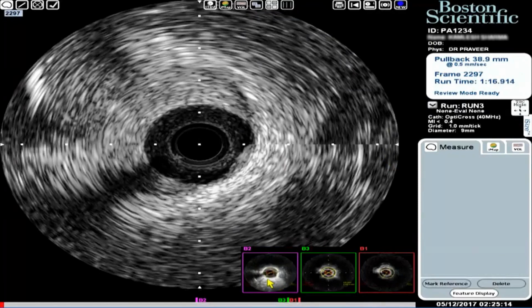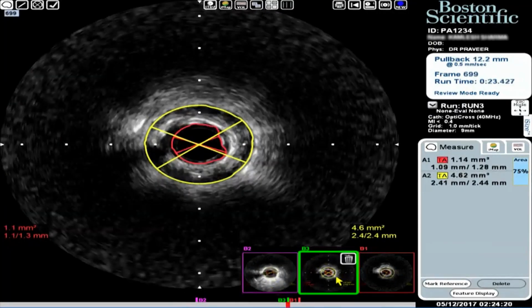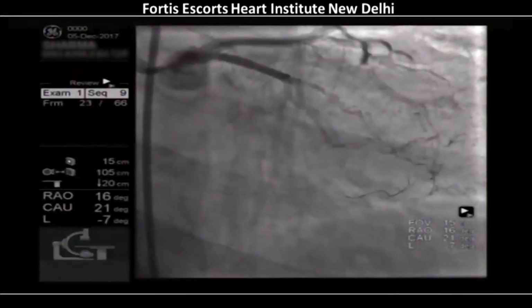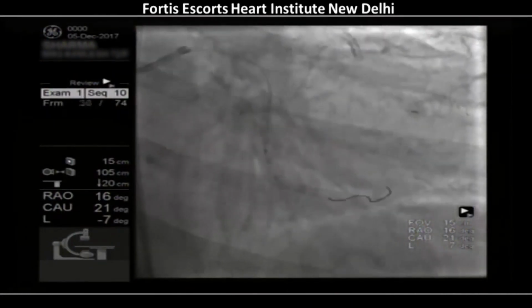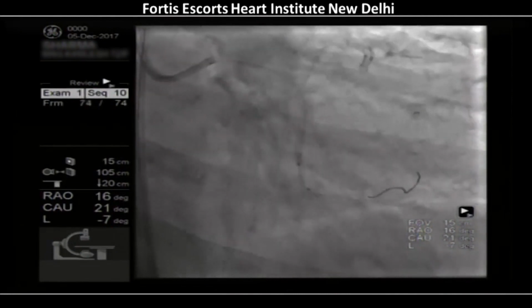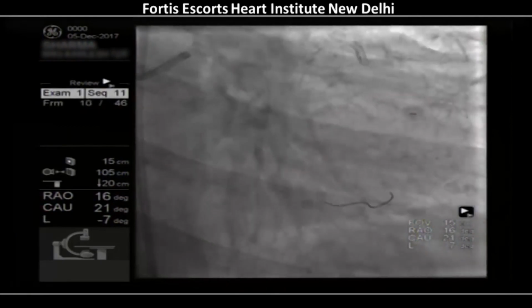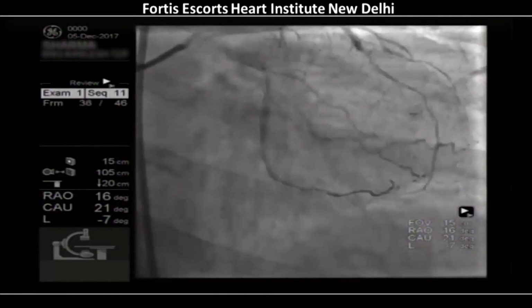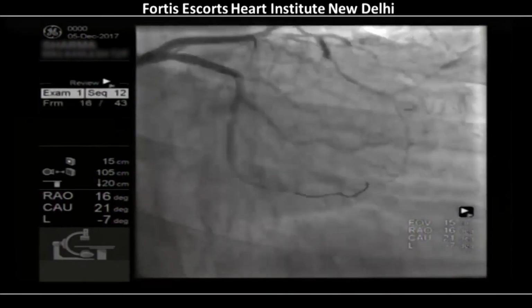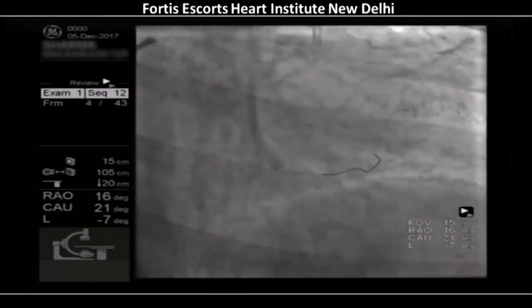Okay, so how will we manage this? Can we see the next angiogram view now? Now what we have done is gently done a 2 millimeter balloon, very gentle, about 2-3 atmospheres, and you see the vessel coming up. It's not a very small vessel. Well, it's big enough to cause ST elevations. You clearly have a disruption right at the outflow.